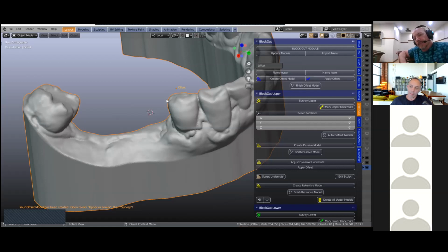Are they equal for Cortex? Because the Cortex sleeve is shaped, its upper shape is a hexagon shape. Oh, yeah. We've got a few hexagon shapes in our Steco one. But all we need to do is, perhaps Wolfgang, you can contact MIS. All we need to do is make cutters for your system, and then we're good to go. You can use your system then.